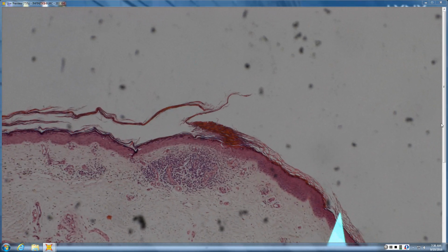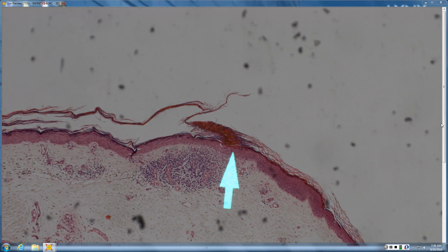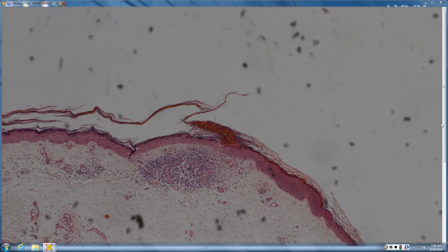Kind of normal, then abnormal. Okay, so there's a layer at an angle with necrotic. Yeah, so cornoid lamellae right there. So there's a cornoid lamella, suggesting that this is porokeratosis. And the center of poro can look like anything. It can be psoriasiform, it can be lichenoid. So the key is noticing those cornoid lamellae at the edge.